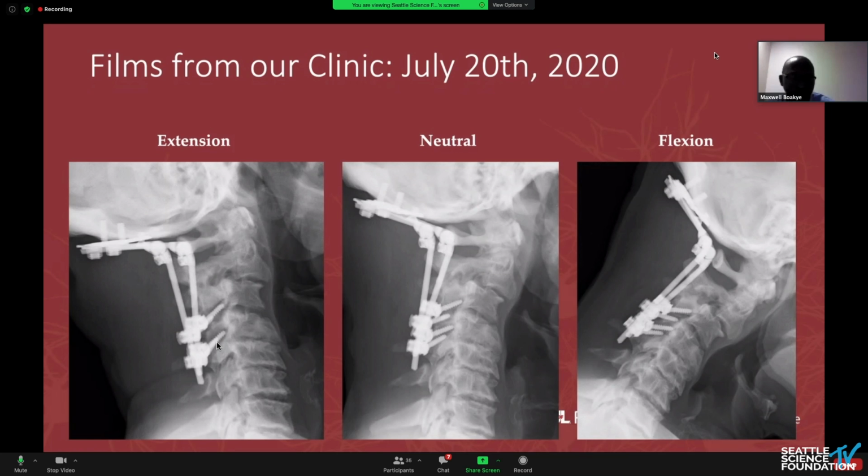That's a great, insightful question for many reasons. I personally like to do it in the same day if medically feasible. So here I take out the posterior hardware. I'd release the posterior joints as good as possible. I think Dr. Huang was just commenting in the chat room on that. And then we'd come anteriorly. We'd do an ACDF C2 through C5, just doing a multi-segmental release of the disc spaces under a microscope, do multi-level uninstrumented grafts in there.